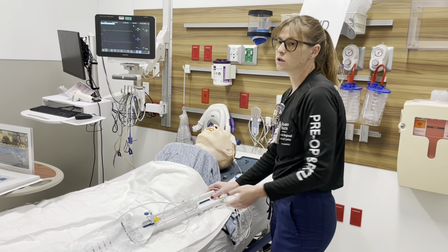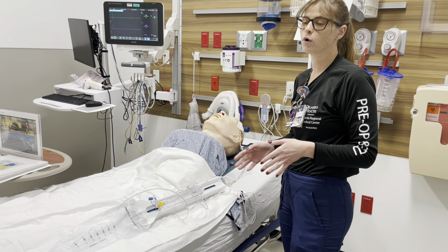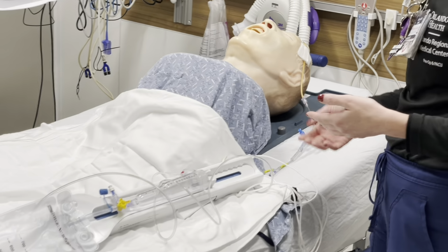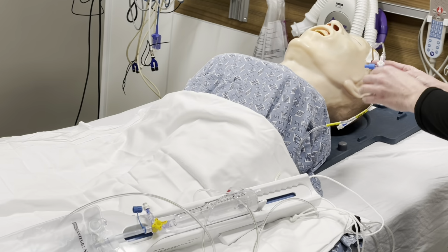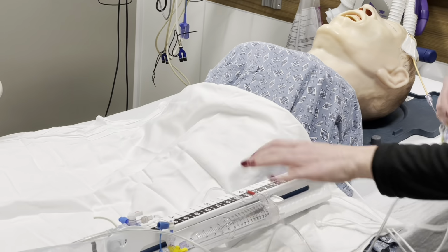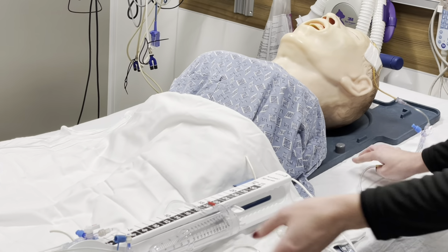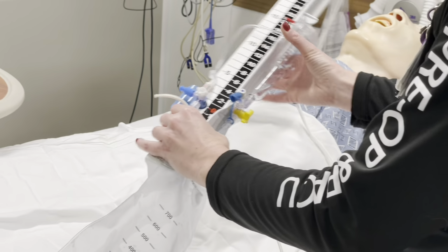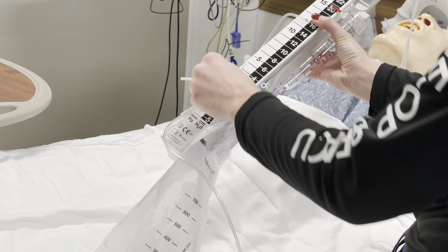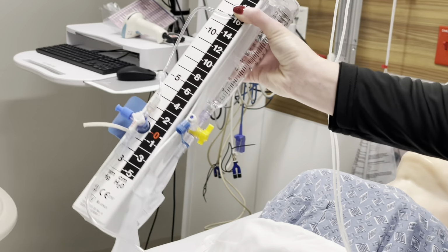So the first thing that we're going to do is go over to our patient and check all of our stopcocks, because again, at this point, we don't know what type of drain it is. So we're going to make sure that this is off to our patient. We're going to trace it all the way down, making sure that we don't have anything sitting on top of it. You don't want this drain being pulled out. And then you're going to go off to the patient this way as well. So off to the patient is going to be downward. You follow the tube all the way down.